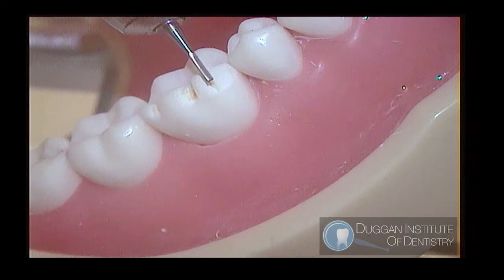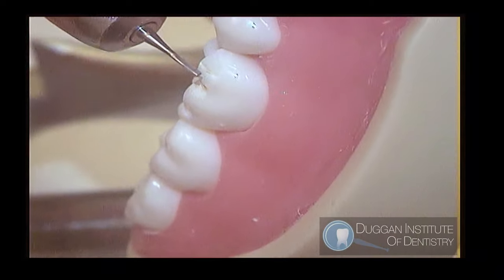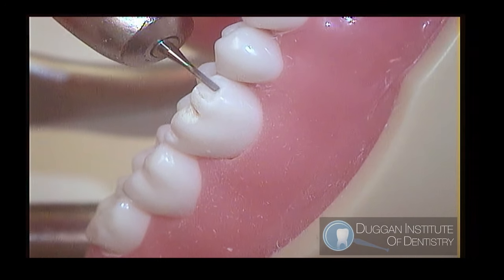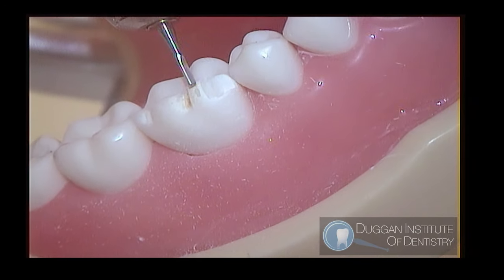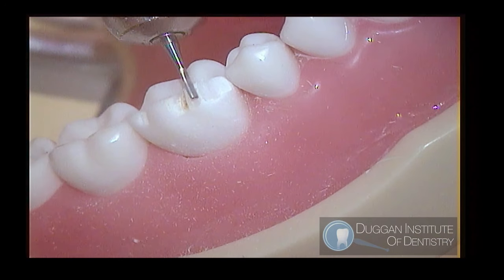Once the angle is established, we can change the burr direction by pointing the burr towards the cheek. This will allow us to create a measurable depth plane that extends along the bevel. The A-plane will eventually extend proximally and connect with the central groove.